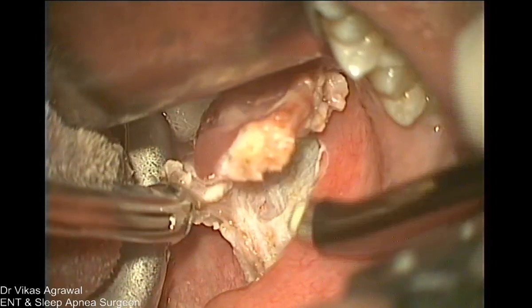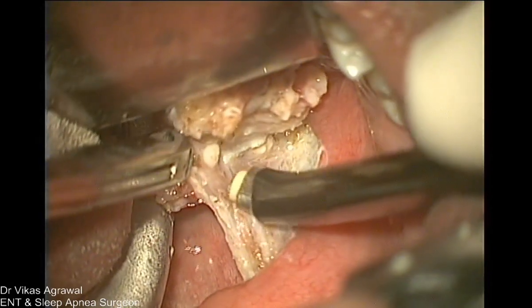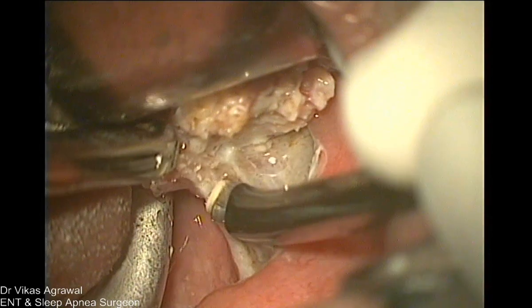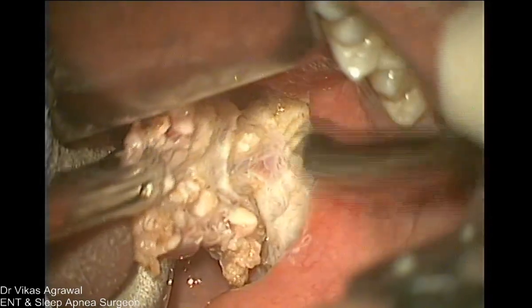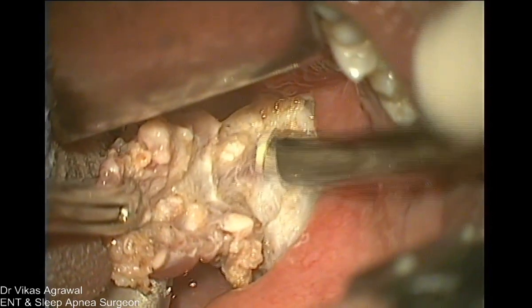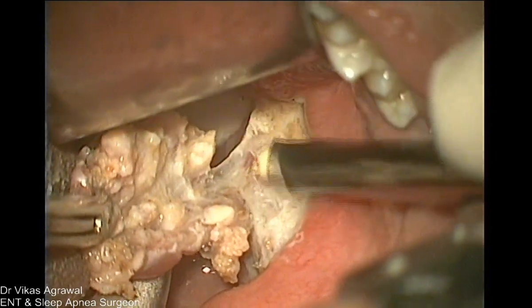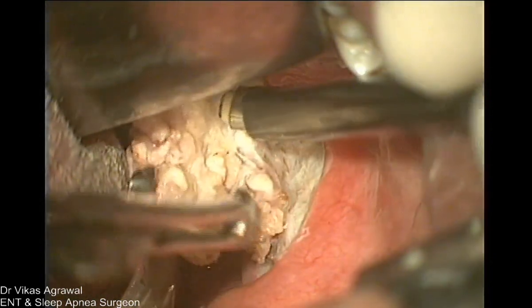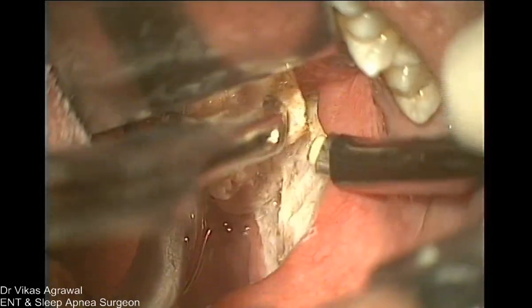Right. So I'm going between the vertical fiber and the oblique fiber here to get my plane. And as I told you, there will be a small vessel here which sometimes can be nasty. Yeah, especially from the posterior pillar. Yes, from here. So if you get a vessel here, you have to coagulate not only the tip of the vessel but also the course of the vessel. Because once you coagulate the course of the vessel, the caliber of the vessel will go down.